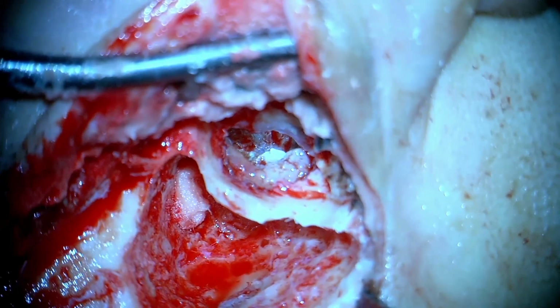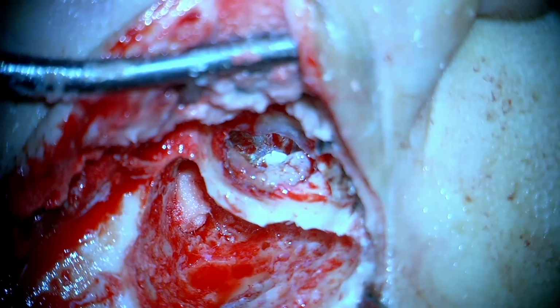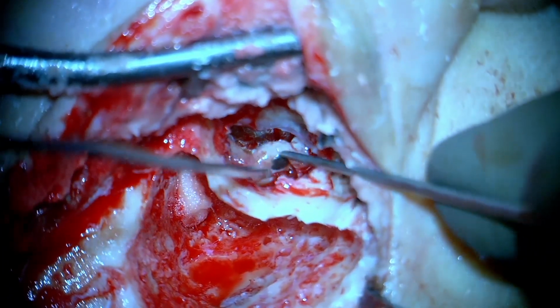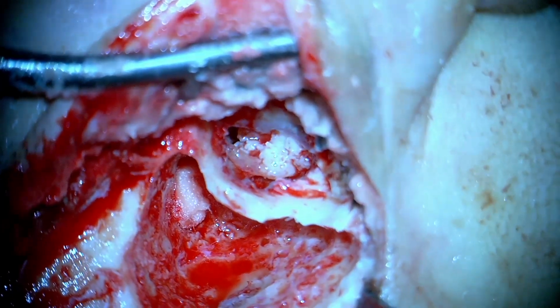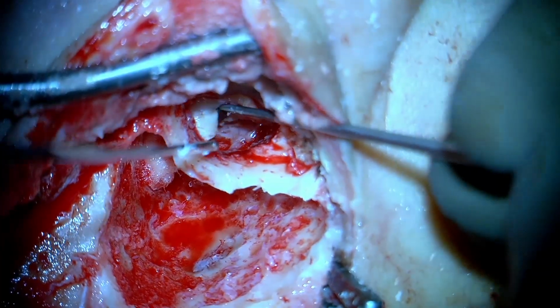Now you see, we've just changed the angulation of the mastoid cavity that we have drilled. The small cotton ball that we have placed here, there's no cholesteatoma. The sigmoid sinus plate can be seen posteriorly. And now we'll see what the external canal concern is. And of course, we have to lift the tympanomeatal flap to see the contents of the middle ear as well.